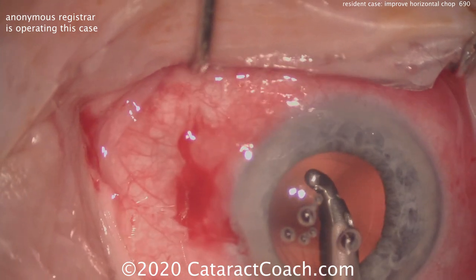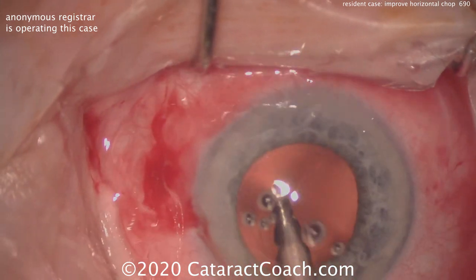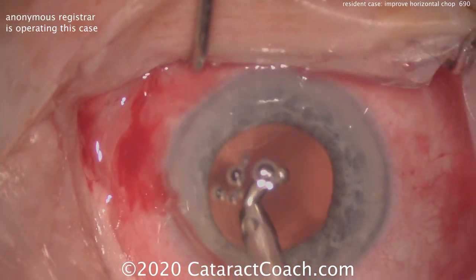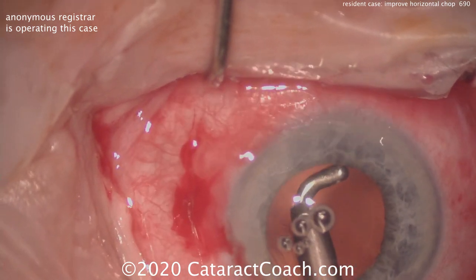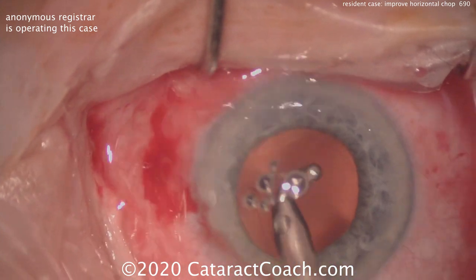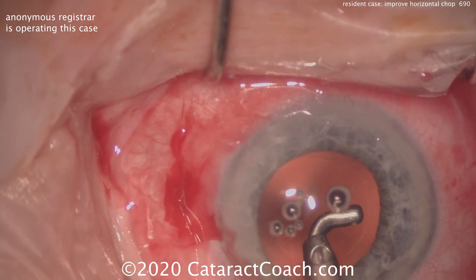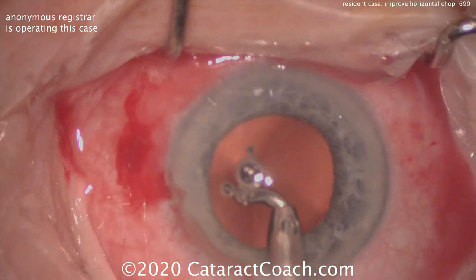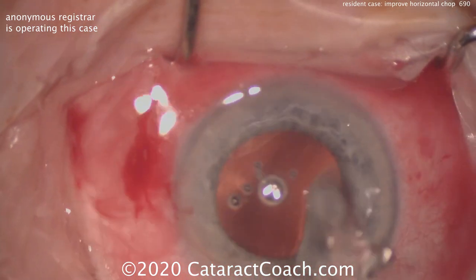Think of it this way — like cutting a piece of meat with your knife and fork. If you hold it still with the fork very firmly so it can't move, then it's easy enough to cut it. But if you're not holding it with the fork and it's moving around your plate, it becomes very difficult to really separate it and cut it into smaller pieces. The same thing applies here.